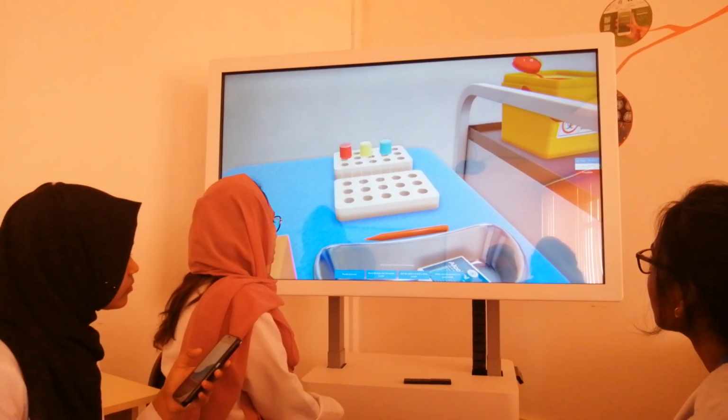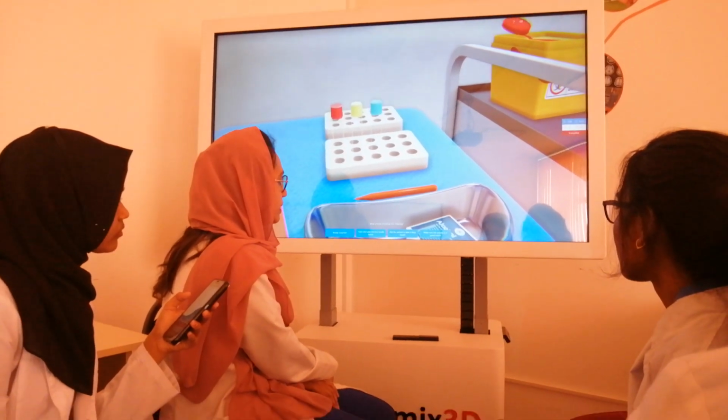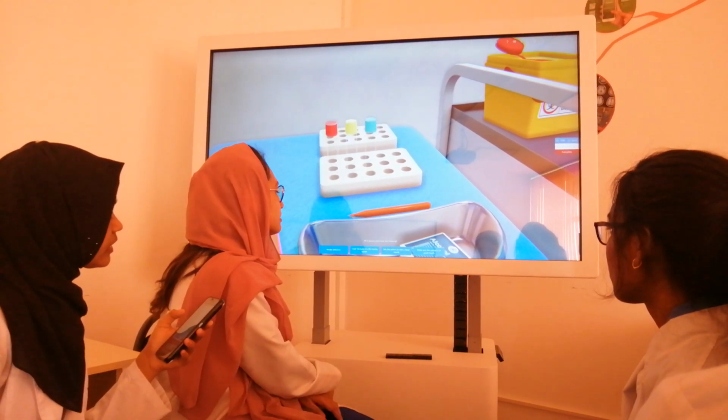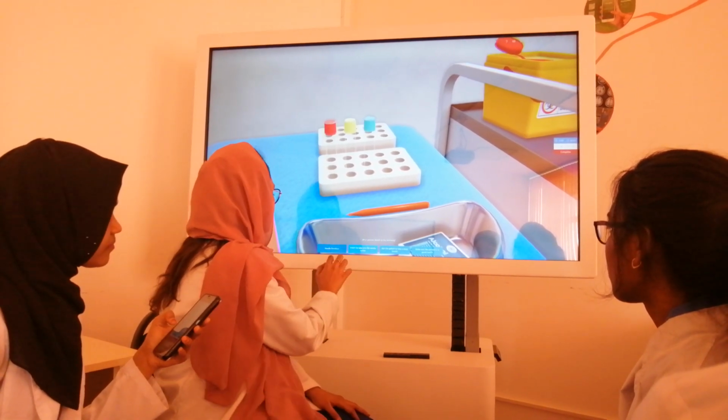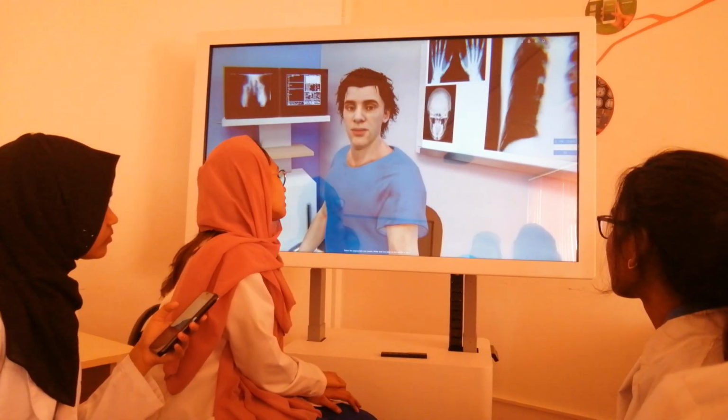What process should be the following? Needle selection. Insert the tube into the needle holder. Ask the patient to take a deep breath. Make sure the patient sits in good health. Needle selection. Select the appropriate size needle. Make sure the label on the needle is intact.